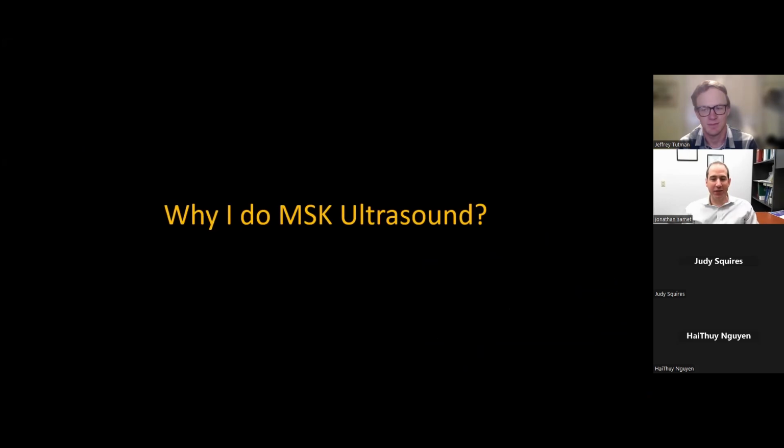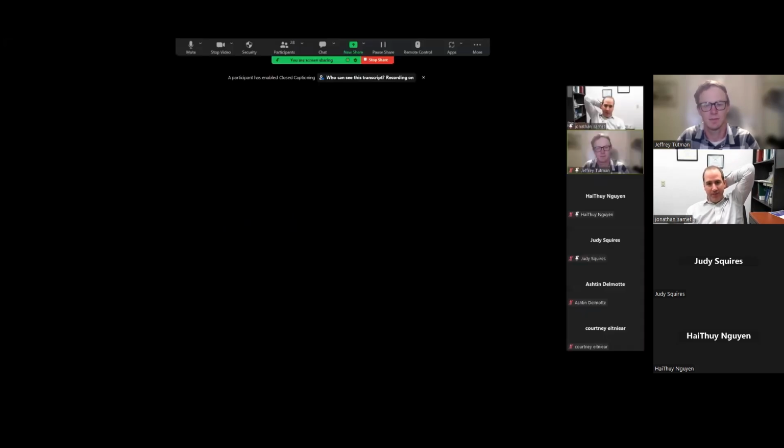So I think the first question you might want to ask yourself, and you might get asked, is why do I do MSK Ultrasound? Why should I do this? I'm going to take you through some examples here to show the power of MSK Ultrasound and hopefully try to convince you of its value.